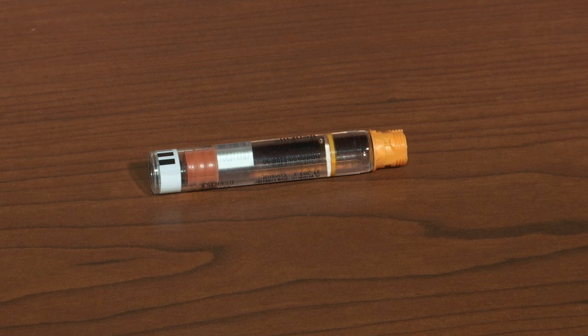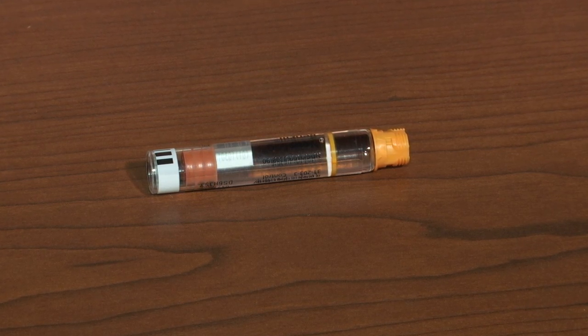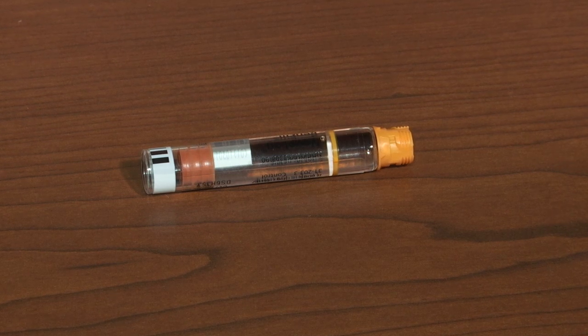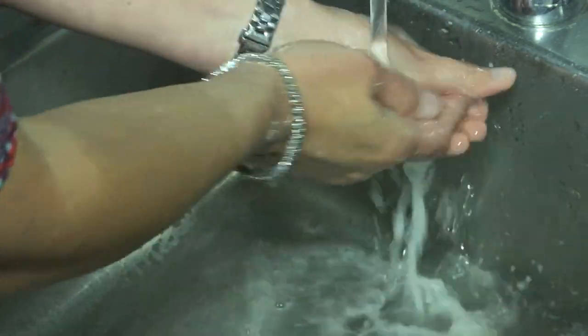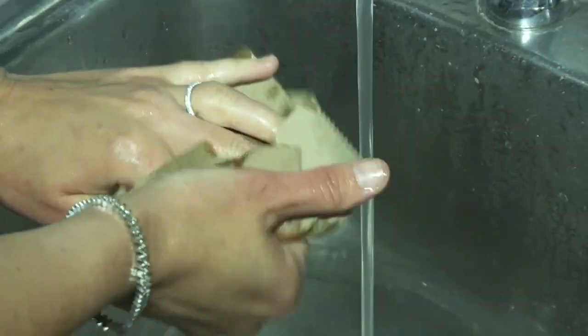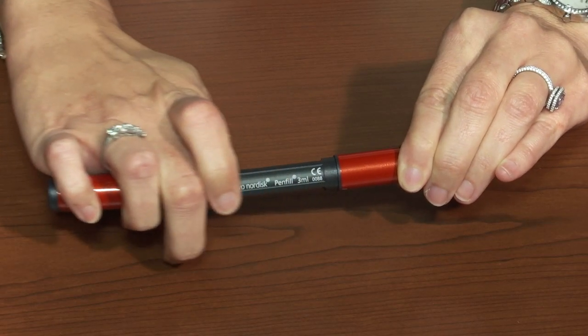An insulin cartridge must be installed when the pen is out of insulin or the insulin has expired. To install the insulin cartridge, first wash and dry your hands, remove the protective pen cap and set it aside.